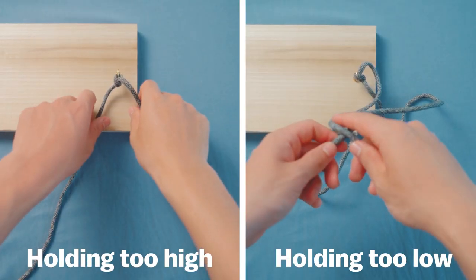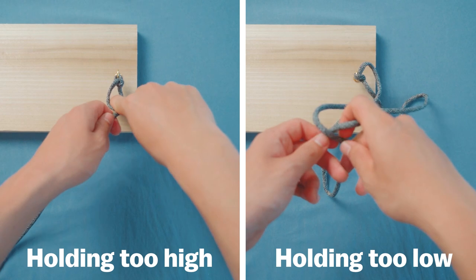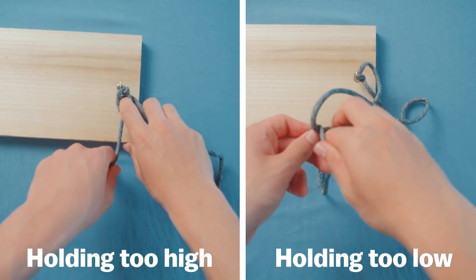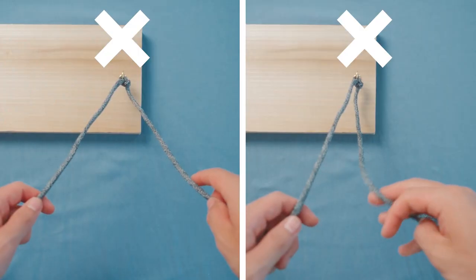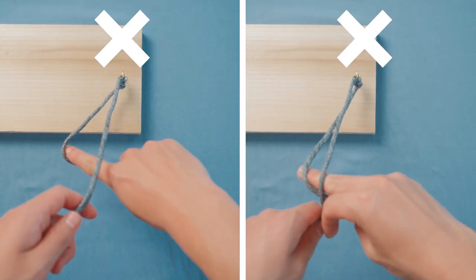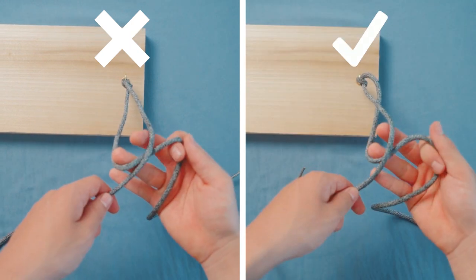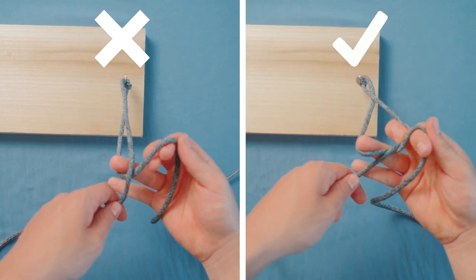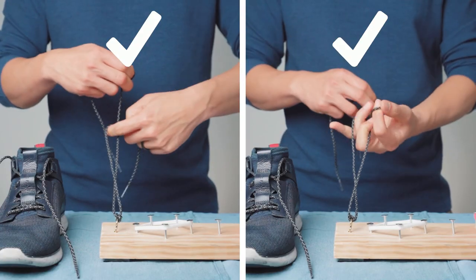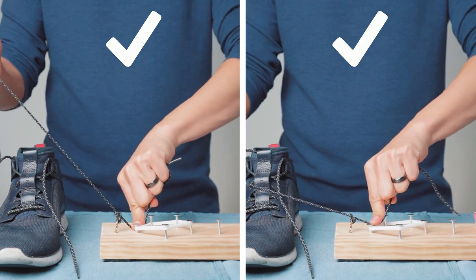Some common mistakes include holding the suture too far away so the tails left at the end are too short, or alternatively holding the sutures too low so there is not enough room to tie. Another mistake is forgetting that forehands must cross over the top while backhands must cross below. Another common mistake is having your fingers exit the loop when trying to pass the tail through. Hopefully being aware of these mistakes will help you avoid them in the future.